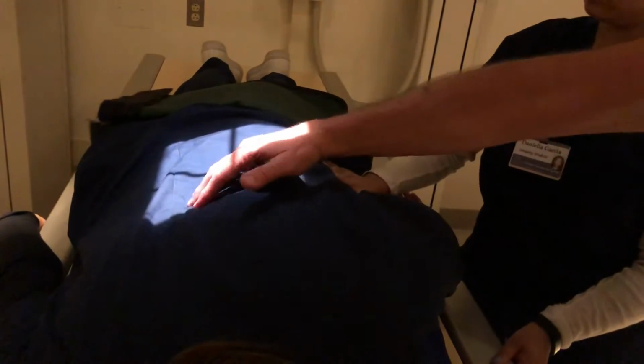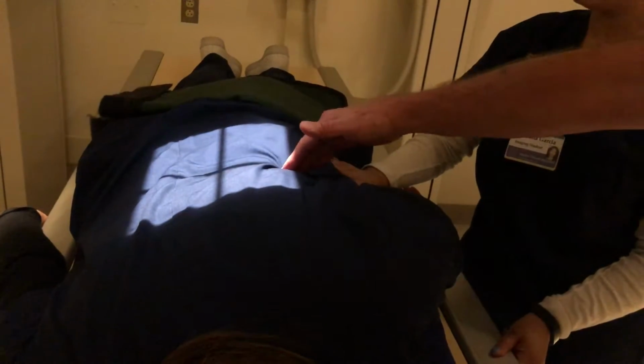So make sure, here's our spine right here. So we're going to be centering over on this side. This is our left side of our body. So we always have the spine on. This is where her spine is because we obliqued her. We have a little bit of light on the spine. Her crest is down here, again, the bottom of the light field at the iliac crest, or the IR. And this would be an RAO.